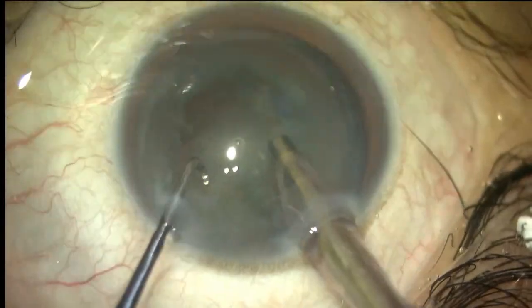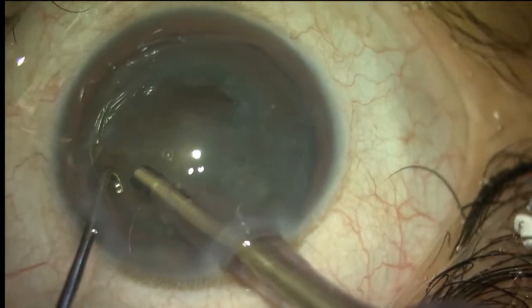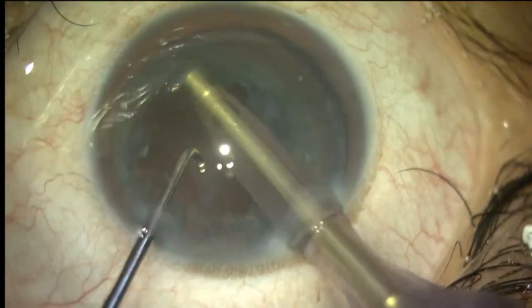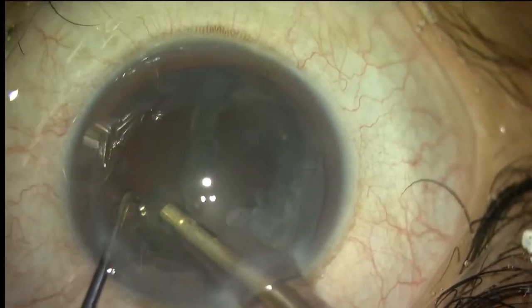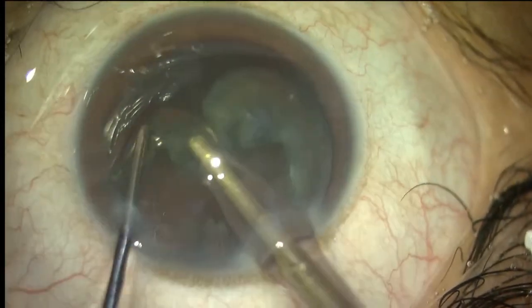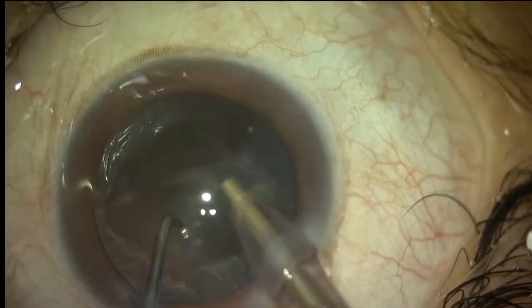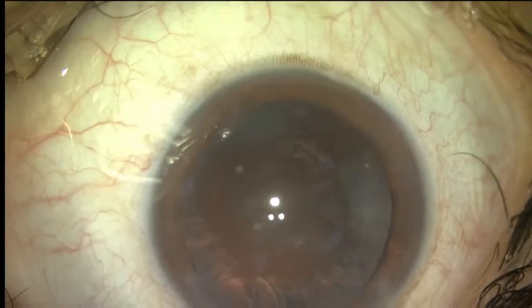So this was the first half of the nucleus. Manual only in all my cases.